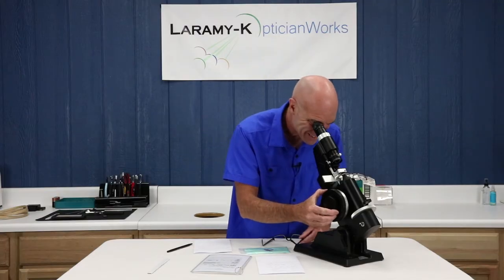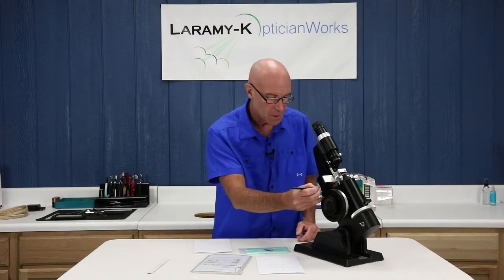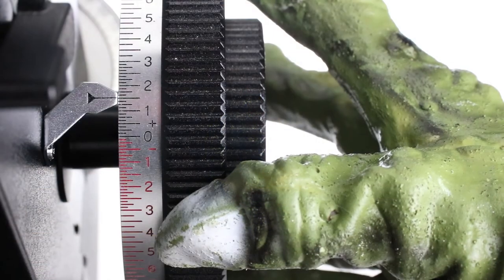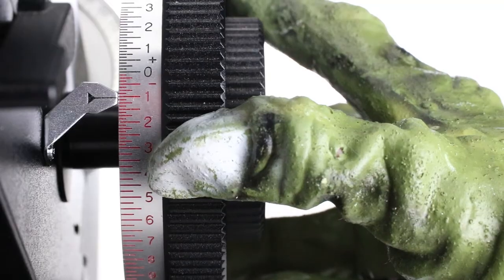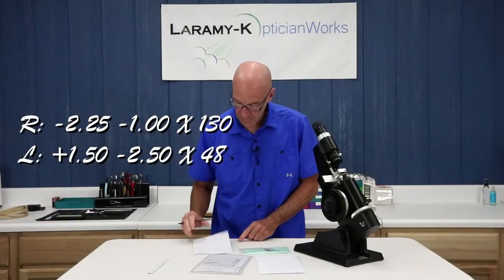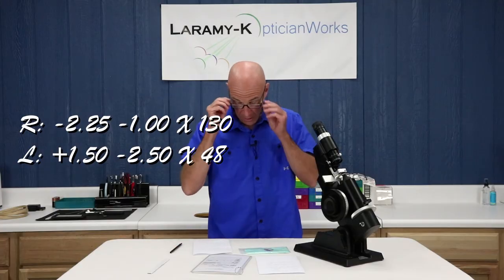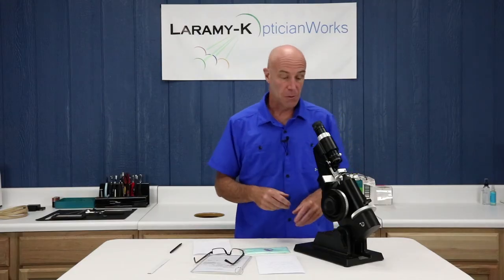Cylinder looks good. I went from plus 150 to minus one — that's 250. So my left is a plus 150, minus 250 at 48. That is what I read, that is what I see in this particular pair of glasses.